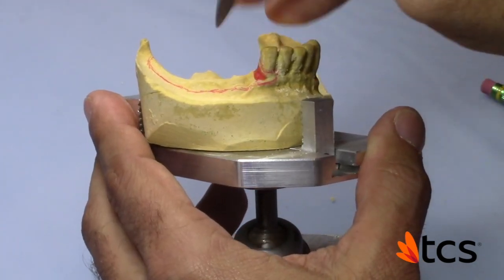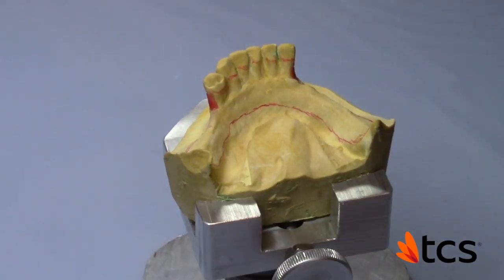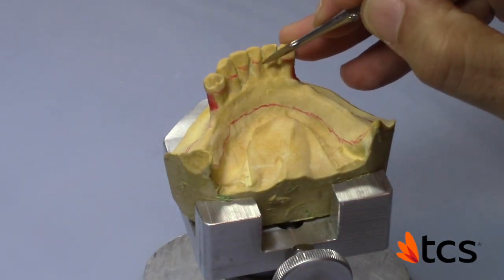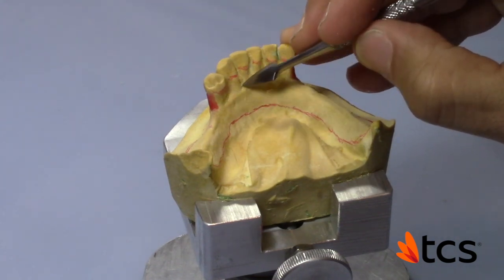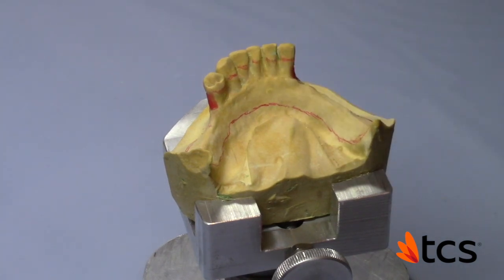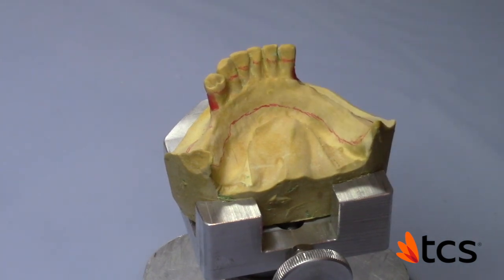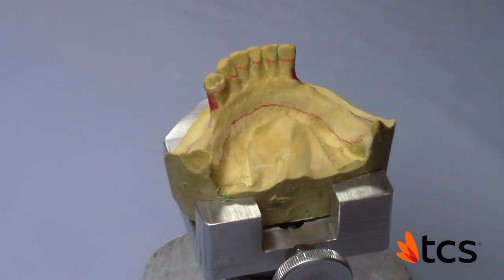These areas here are not of any concern to me. In my finishing I may just take off some of the sharpness in these areas, but overall it's not bad to the point where I need to block it out — I can just smooth it out somewhat in my finishing. And that's it.